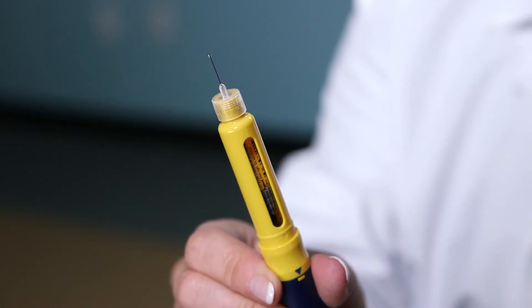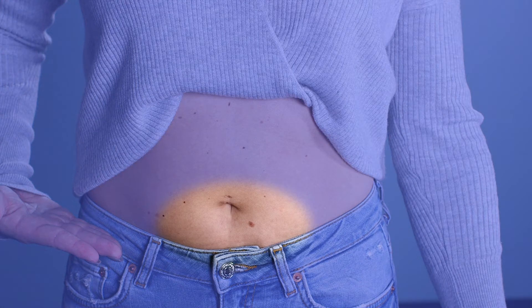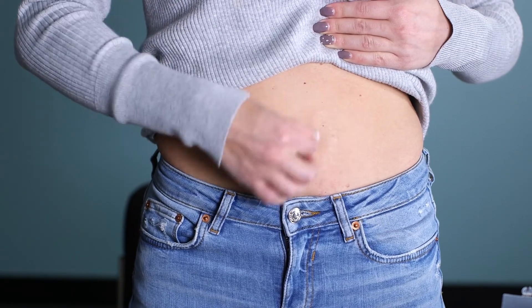You're now ready for your subcutaneous injection. Make sure you wash your hands with soap and water. The most common site is the abdomen, using the left, right, or below the belly button, staying approximately one to two inches away from the belly button. You can also use the back part of the upper arm or the outer aspect of the upper thigh. Alcohol wipe the site where the injection is going to take place.